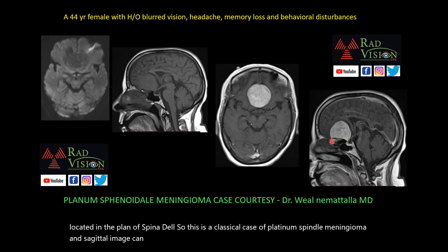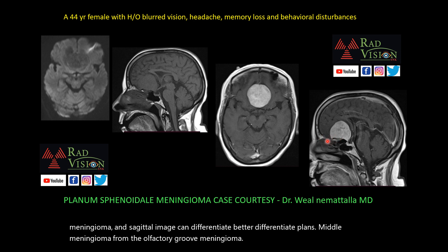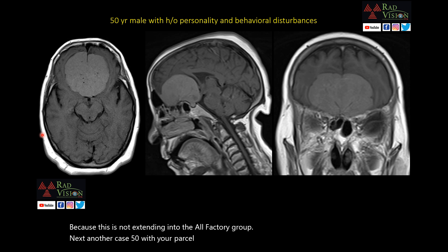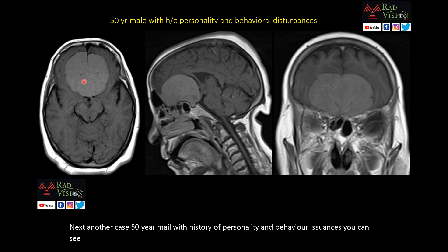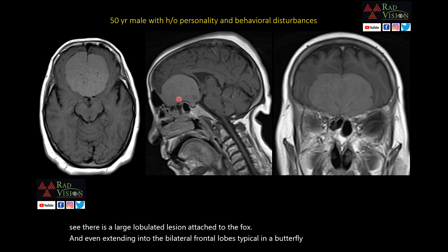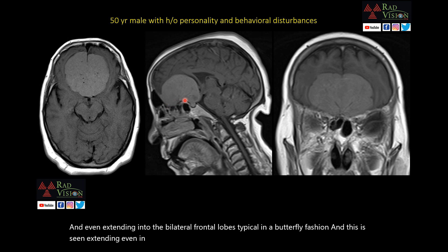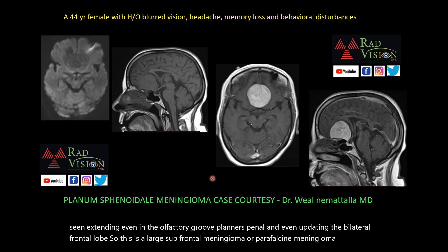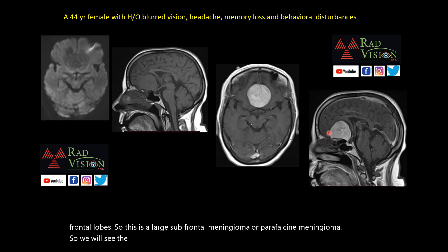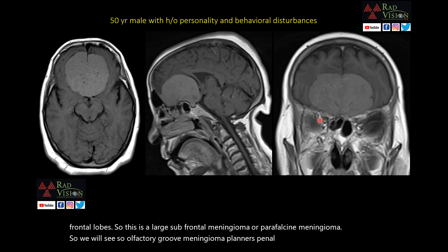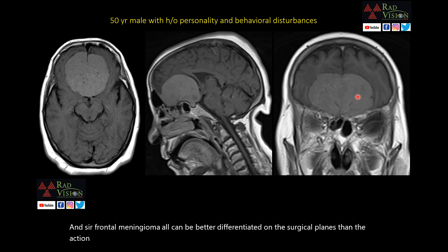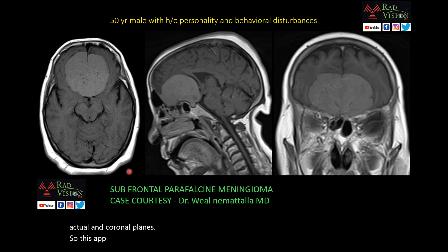Sagittal imaging better differentiates planum sphenoidale meningioma from olfactory groove meningioma. Next case: a 50-year-old male with personality and behavioral changes. There is a large lobulated lesion attached to the falx extending into the bilateral frontal lobes in a butterfly fashion, involving the olfactory groove, planum sphenoidale, and abutting the bilateral frontal lobes. This is a large subfrontal or parasagittal meningioma. Olfactory groove, planum sphenoidale, and subfrontal meningiomas are all better differentiated on sagittal planes than axial or coronal planes.